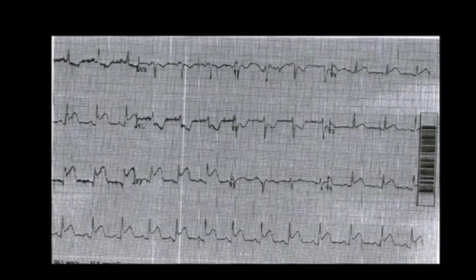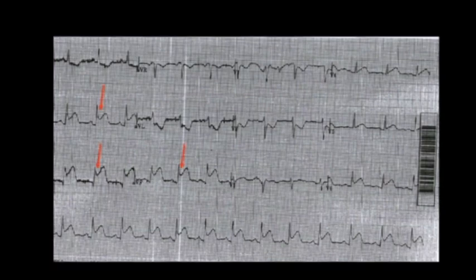Which EKG leads look at the right ventricle? The answer is that none of the standard 12 leads on an EKG look at the right ventricle. So, the standard 12 lead EKG in this inferior wall MI with right ventricular MI will look exactly the same as any other inferior wall MI. There will be ST elevations in leads 2, 3, and AVF. So how do we know if we are dealing with an isolated inferior wall MI or an inferior wall MI with a right ventricular MI?